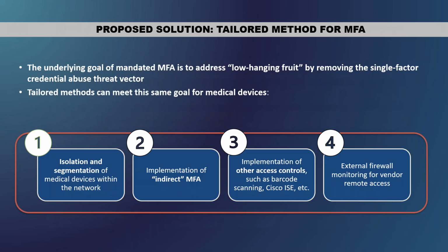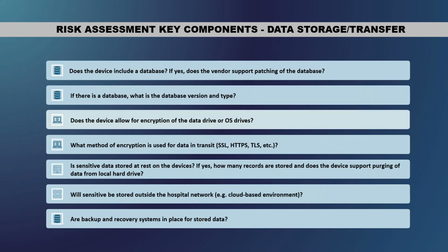Next slide. Okay, so now we're going to do data storage and transfer. Data is important, obviously, for protecting patient information. So what I usually start asking when I evaluate medical equipment is, does it have a database? Does the database support patching? What I've started to notice with a lot of ultrasounds is that they have databases. Those are the things you need to start digging into.